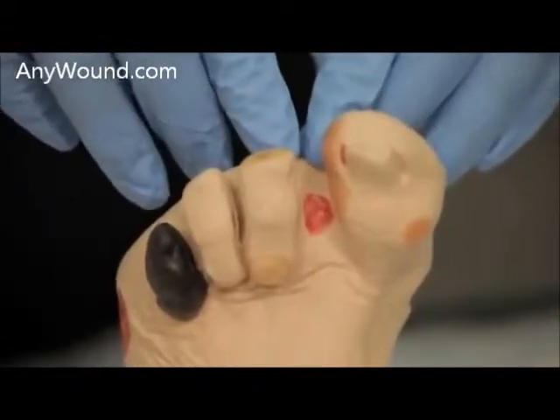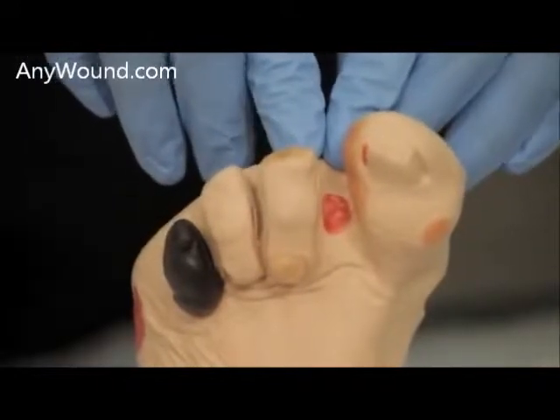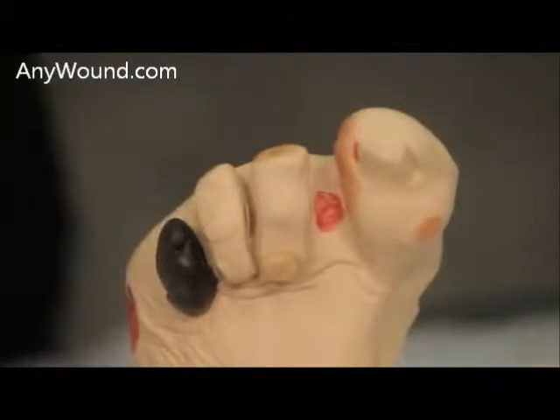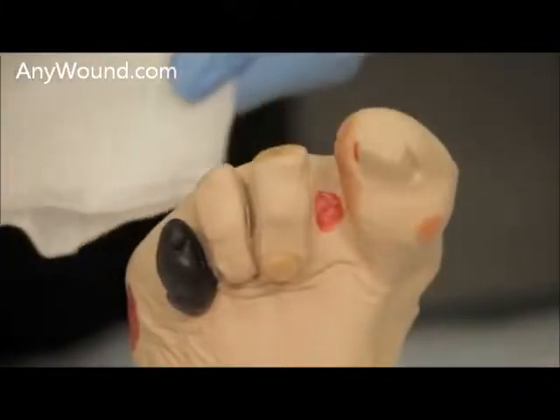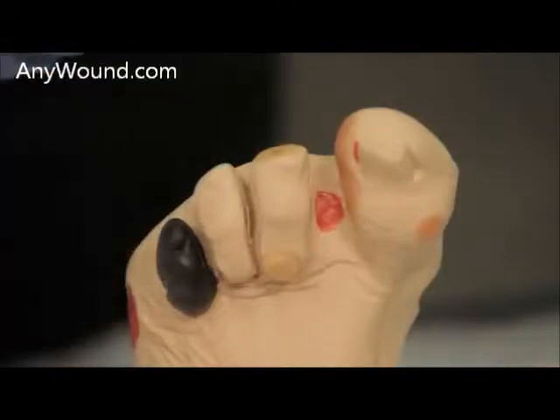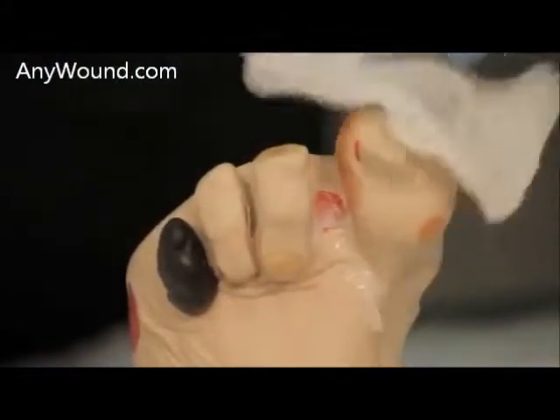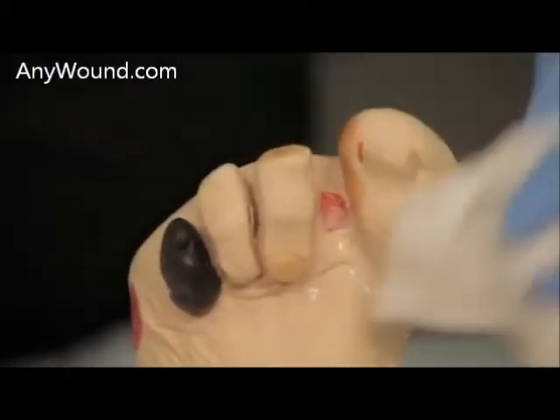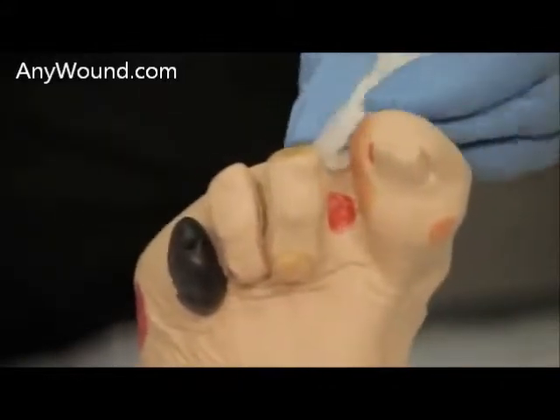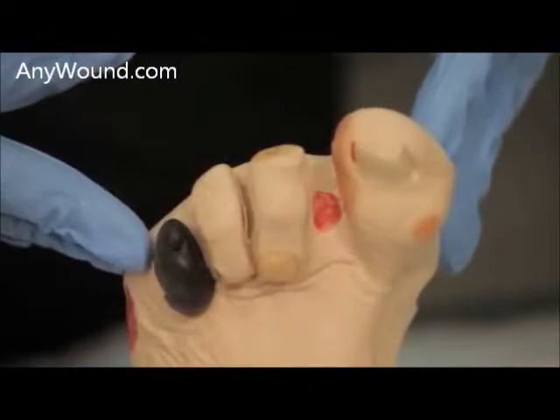The next thing you'll want to do is cleanse the wound with a wound cleanser and gauze. You can spray the wound directly, or you can spray the dressing, however you prefer. Clean some of the excess, clean the wound bed, and now the wound bed is ready for dressing application.